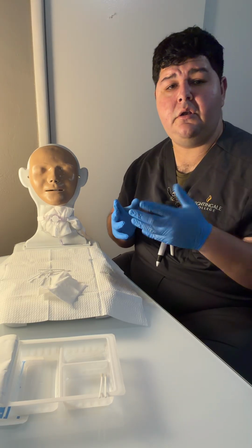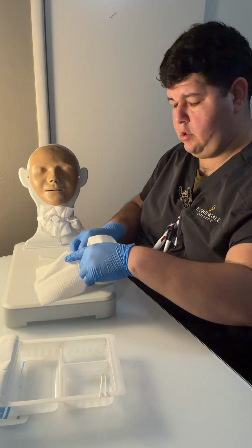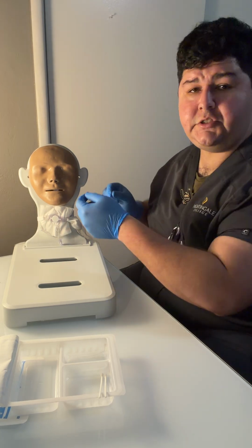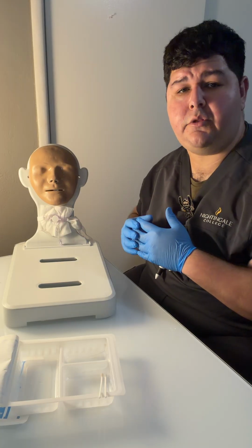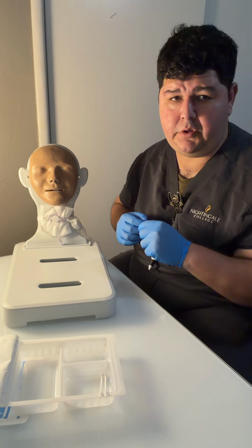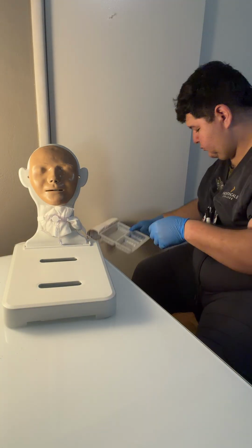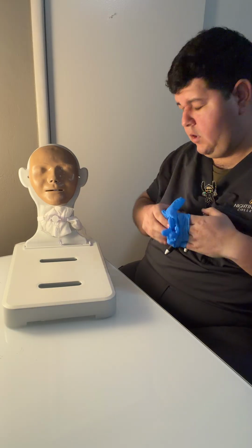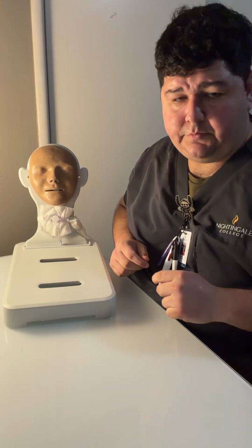At this point, we would clean up our items. We would replace our patient's oxygen, place them in a position of comfort. I would want to ensure that the bed is in a low and locked position, and I want to ensure that the call light is within reach. I will discard the remainder of our supplies, remove my gloves, perform hand hygiene, and then go and document our procedure.